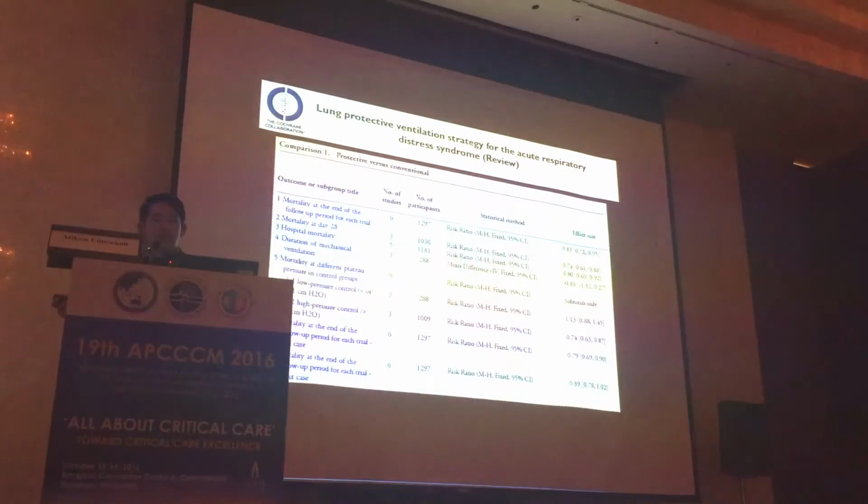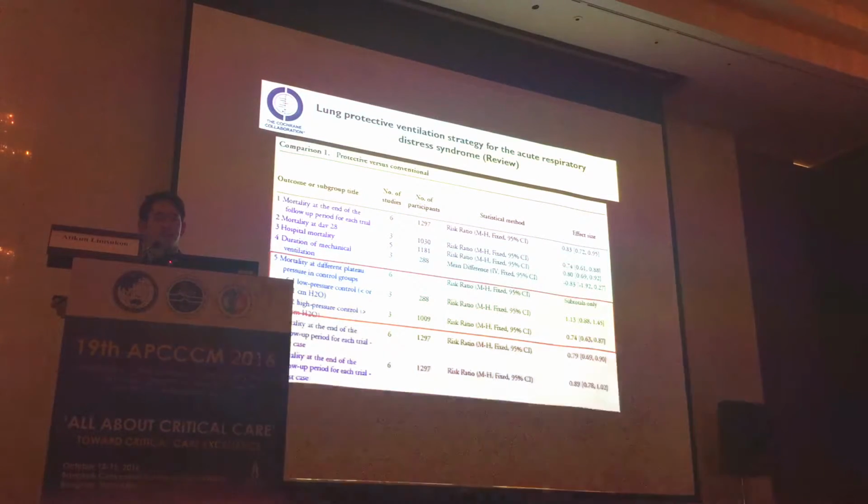But when we look into the details, the small tidal volume is not always better than the large tidal volume. It will be better if those patients who are subjected to large tidal volume also had an accompanying high plateau pressure, meaning that those patients are very severe and the lung mechanics are very poor. But for the group with a large tidal volume but a plateau pressure that is not that high, meaning less sick patients, the low tidal volume may not convey a benefit over the large tidal volume.